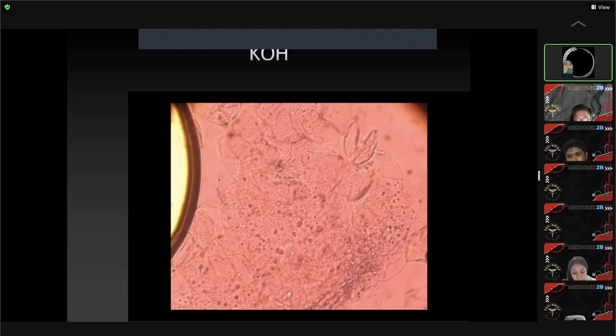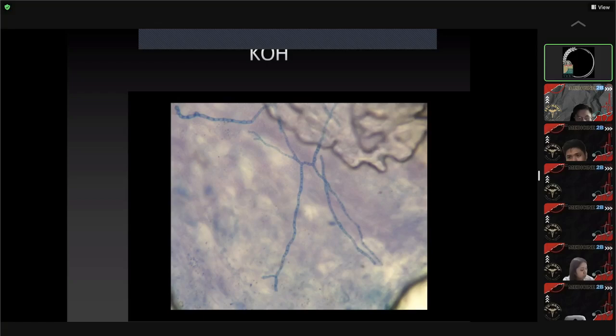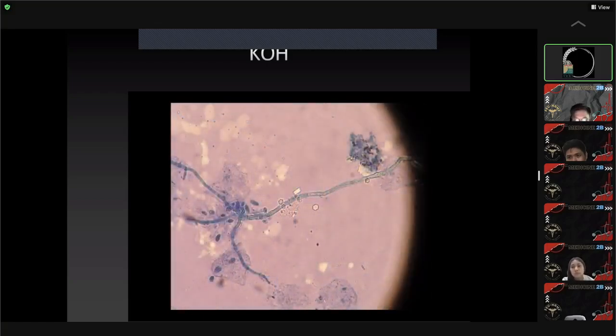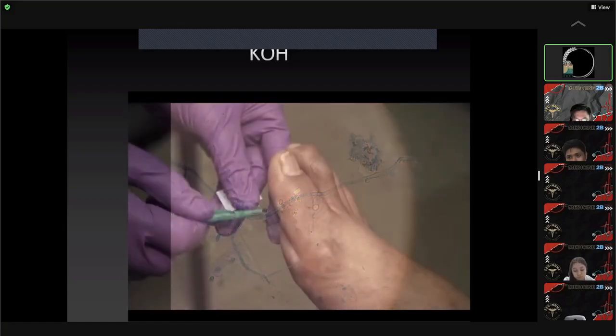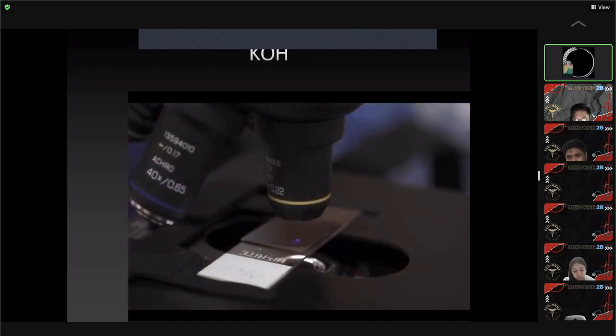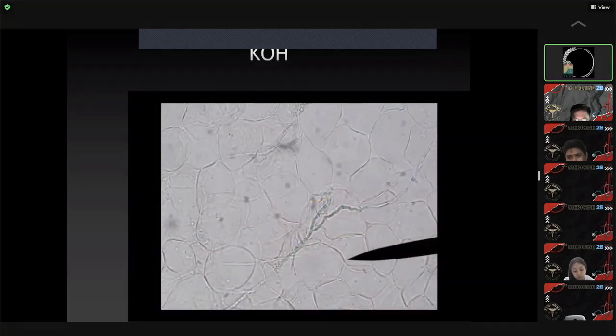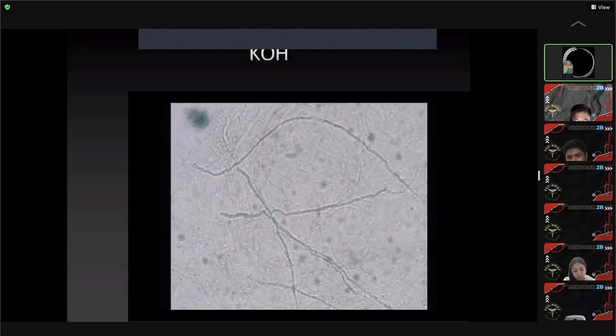The most common causes of false positives occur when the clinician overreads overlapping cell borders or other artifacts as hyphae, or overreads micelles from topical medicines as yeast forms. The goal is to find fungal elements on high power with definitive fungal morphology, such as septate branching hyphae or pseudohyphae with buds. False negatives occur when the scraping is inadequate or the clinician does not look at sufficient low-power fields to screen the slide. See how the fungal stain helps the fungal elements stand out from the human cells and therefore increases the sensitivity of the preparation.